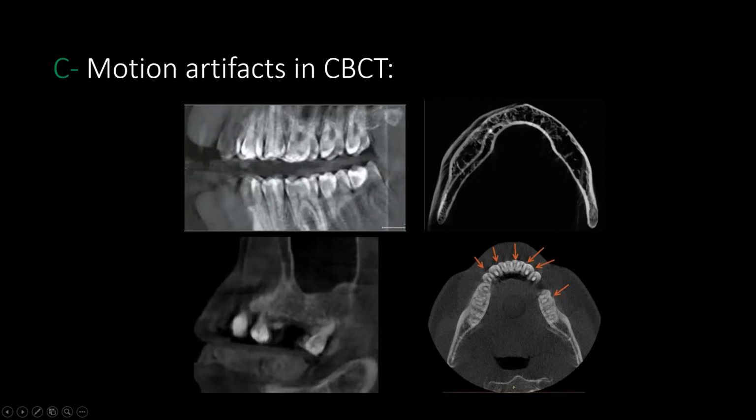So make sure that you check the CBCT before your patient leaves the office, and make sure that it's free of motion. Again, you would like to have the most accurate treatment planning, and that is only possible if you have a CBCT that is free of motion artifacts.